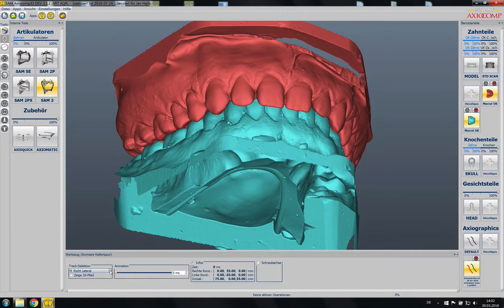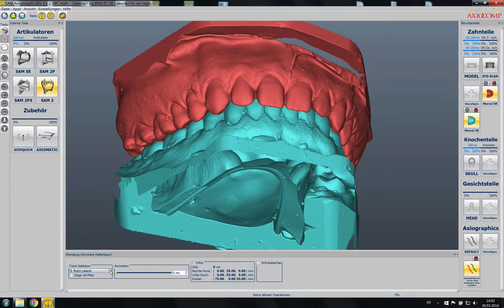I also imported the Axiocomp recorder data so I can animate these two jaws with the original patient's movements as recorded with the jaw tracker.